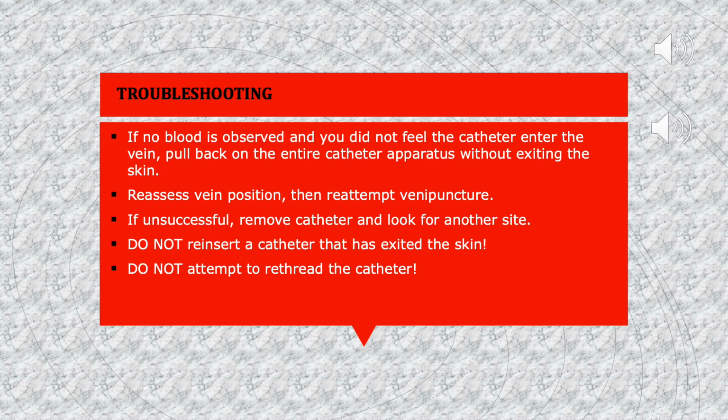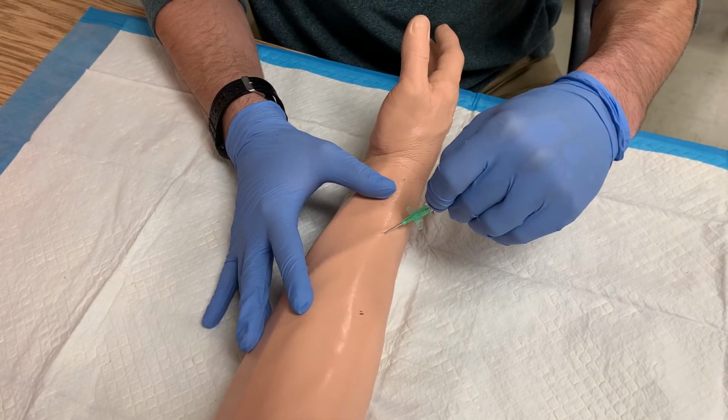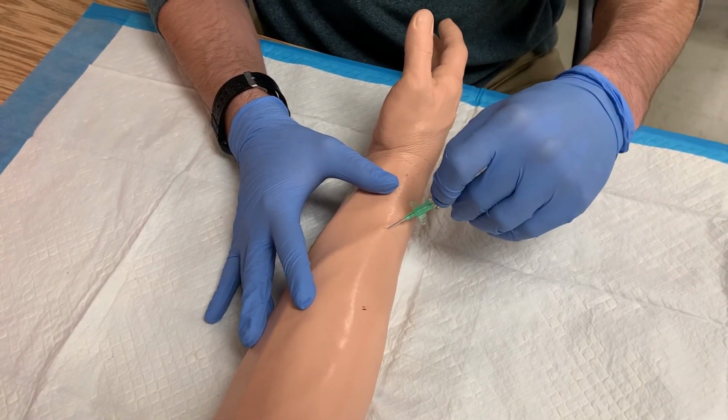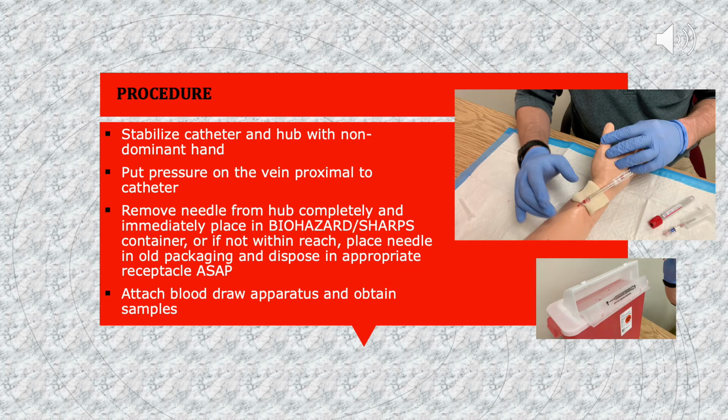Be aware that reinserting the needle into the catheter or rethreading the catheter onto the needle can result in damaging the catheter or breaking a piece off, which is likely to end up in pulmonary circulation. Holding the assembly steady, advance the catheter until the hub is at the venipuncture site. Stabilize the hub with thumb and index finger of the non-dominant hand. Put pressure on the vein proximal to the catheter with a finger to eliminate or reduce blood oozing out of the catheter.